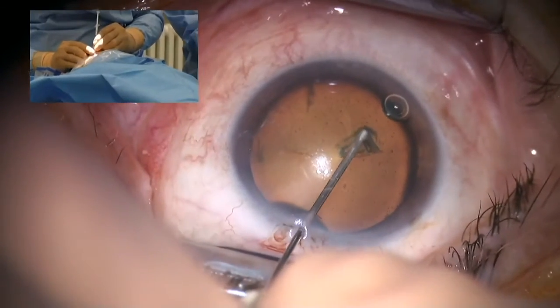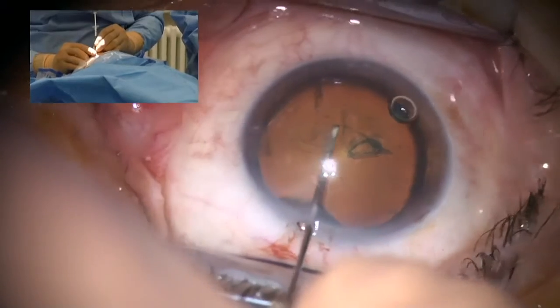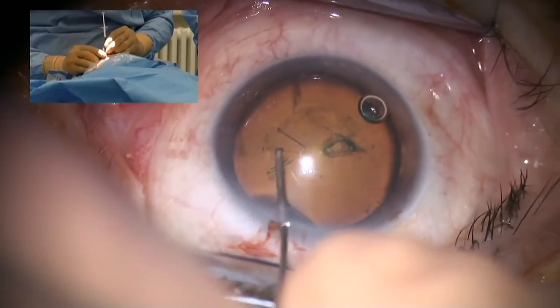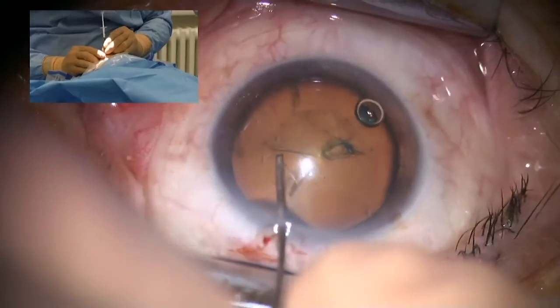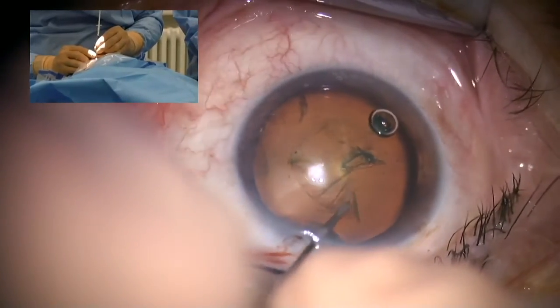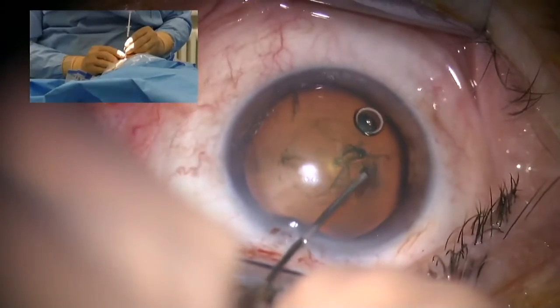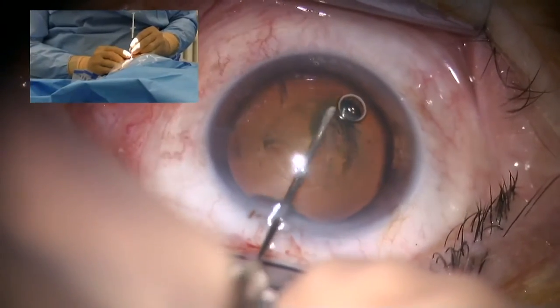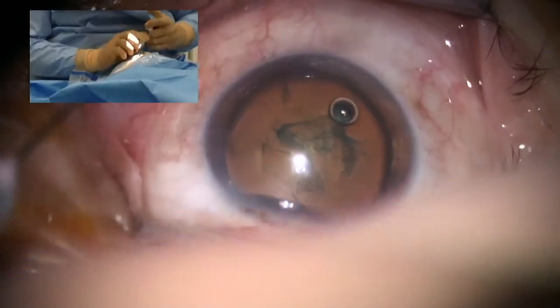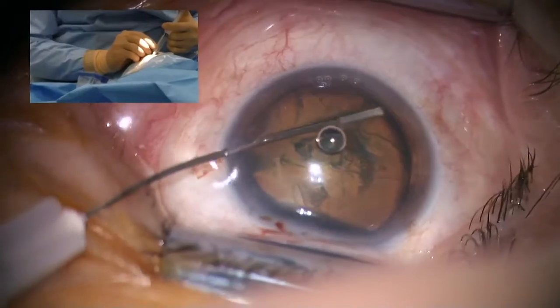I normally use the needle to do the capsulorhexis. You can use from femtolaser, as you know, to forceps, whatever you want. Hydrodissection, hydrodelineation.